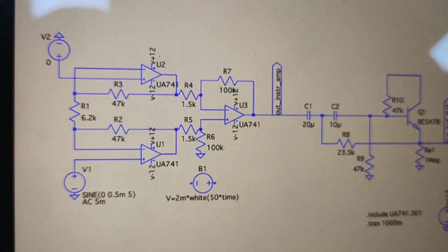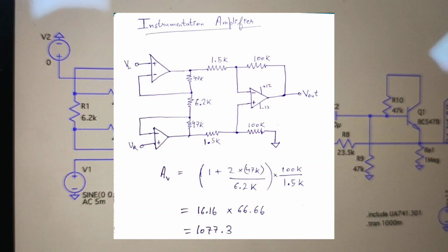The first stage of our circuit is the instrumentation amplifier as shown here. We are using three UA741 op-amps configured in a classic instrumentation amplifier topology. The advantage of this configuration is that we can achieve high gain with excellent common mode rejection, which is crucial for eliminating noise that appears on both input electrodes. This stage amplifies the differential signal between the two electrodes while rejecting common mode noise.